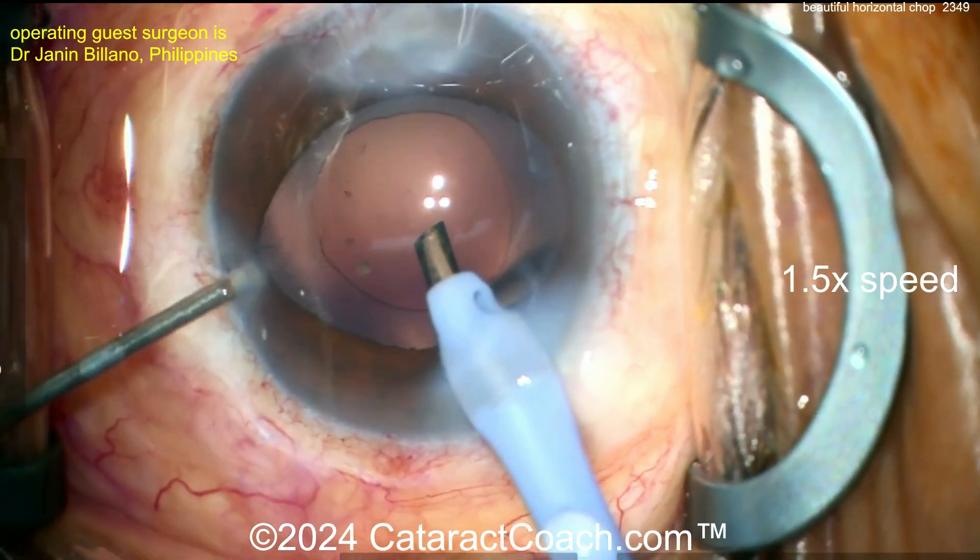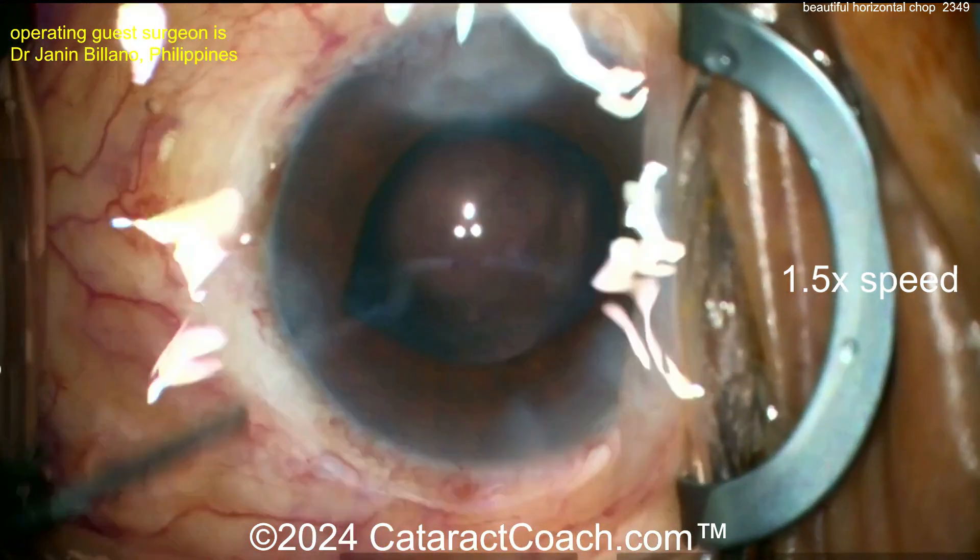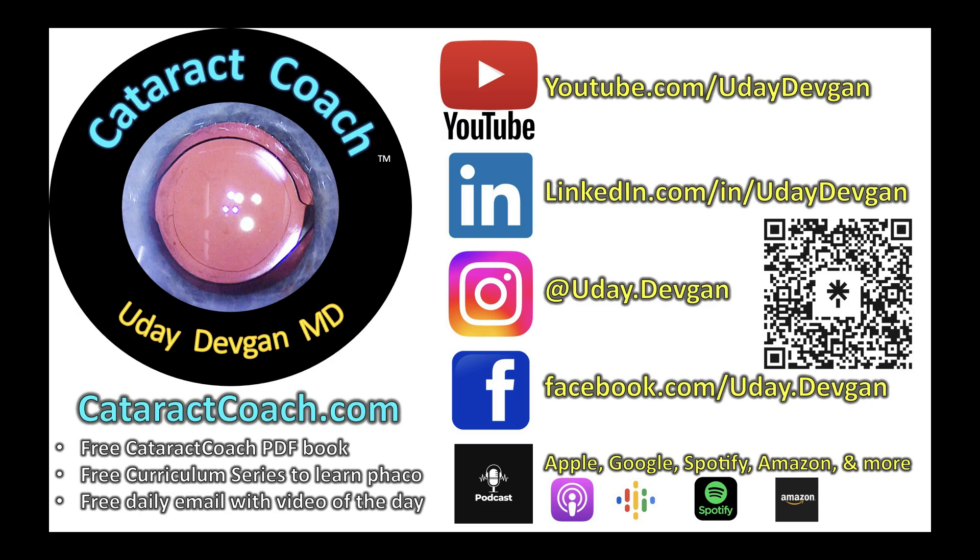We'll finish up the case here — beautifully done. I want to commend you for doing a fantastic job, keep up the great work, and please send us more videos in the future. Remember, if you're a young doctor, cataractcoach.com has so much great material — a free PDF book to learn surgery, free curriculum series, free everything. Just go check it out.